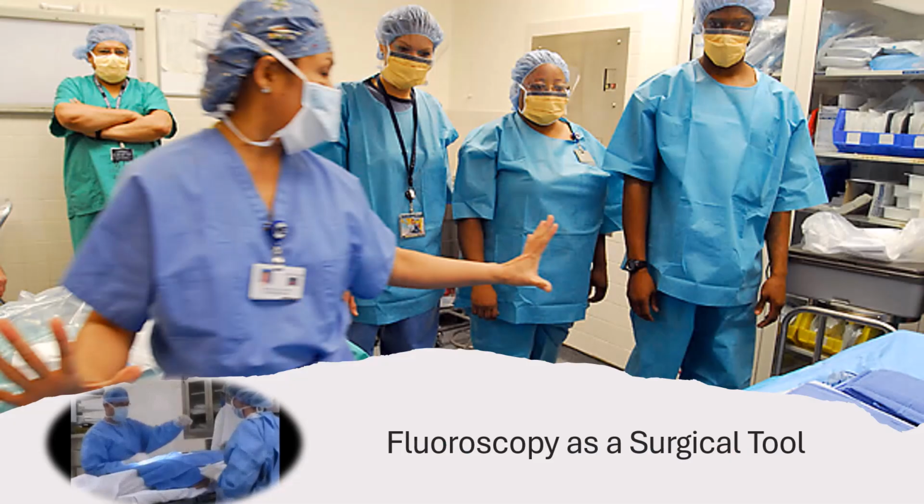Although many surgical procedures are now done as interventional radiology procedures, we still have a number of procedures that need fluoroscopic guidance for the surgeon in surgery or intraoperative radiology procedures. This is especially true when looking at trauma surgeries, orthopedic surgeries, and neurosurgeries.